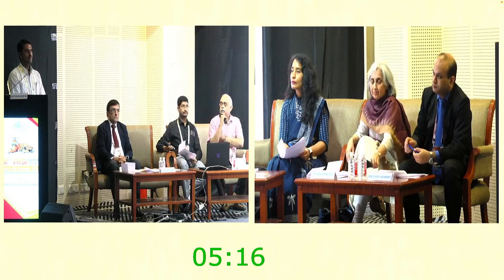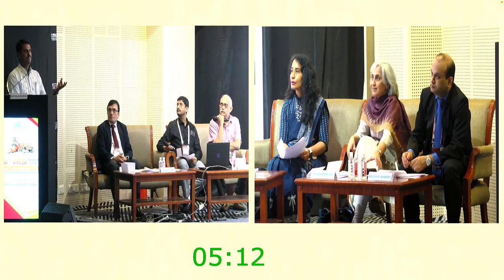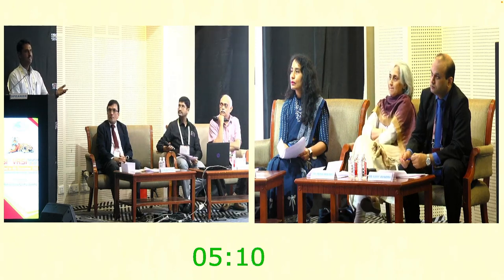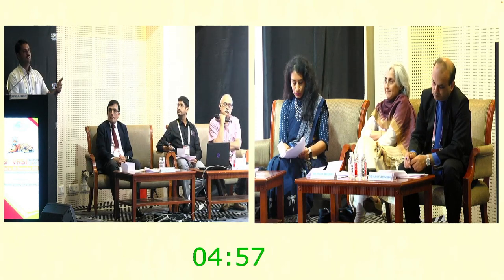The first question you had asked was why didn't I repair it at the same time? Because it was under local anesthesia. The patient was already getting very tense about it. Even I was tense because we didn't know what was happening. It was just not holding up. Then I opened the conjunctiva to see a tear. I thought it was very small, looking at it from inside the retina, but the tear in the sclera was quite large.